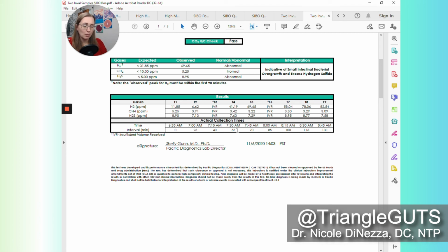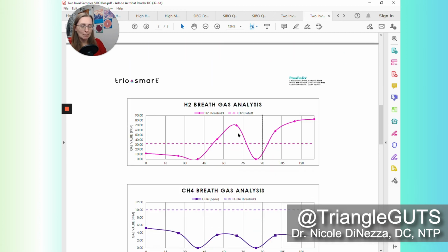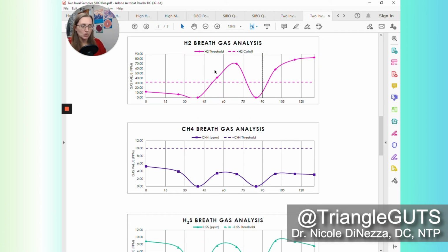And it could be that we're looking at colonic fermentation, but again, I'm going to be a little bit more cautious and probably chalk this up to SIBO. So let's see. The difference between, let's say, 6.5 and 41 is sure going to pass that diagnostic criteria of 20. Again, God knows why they keep changing this, but 20 parts per million for hydrogen is pretty well accepted. So I would consider this to be a probable case of hydrogen SIBO.